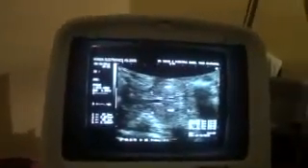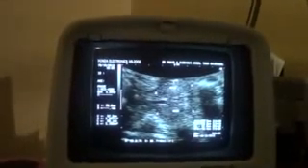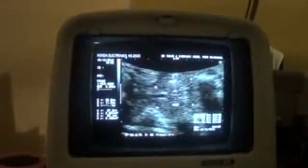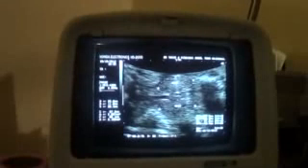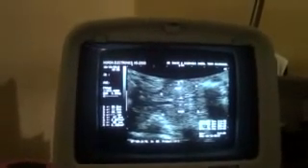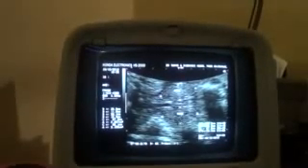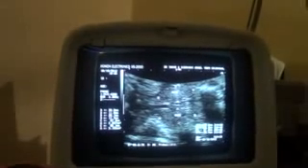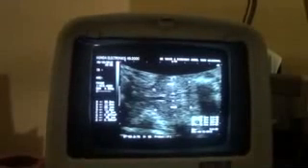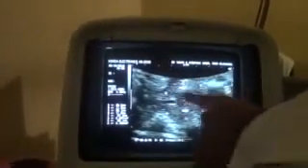In this location, if we measure the lobes separately, the measurements are in longitudinal section, both measure 2.8 centimeter. In anterior posterior diameter, both measure approximately 11.8 millimeter. So the dimensions of both masses are the same.